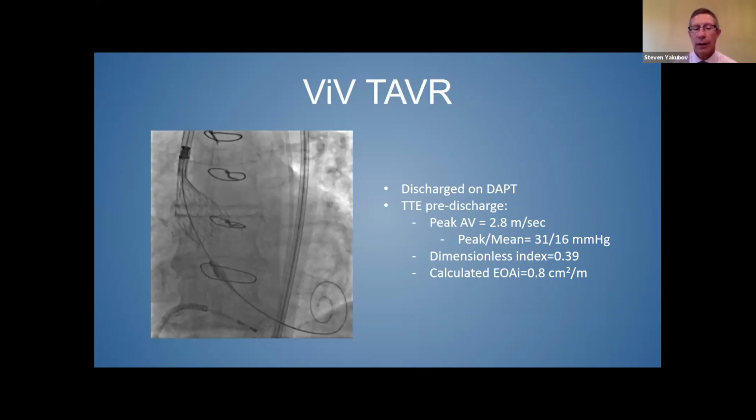Yeah, it's rare that we do valve-in-valve TAVR without post-dilating at the end. So often I see that the TAVR valve is not fully apposed to the surgical valve, even though you don't have PVL. It looks like there's space between, and that might be the inner diameter that I'm mistaking.